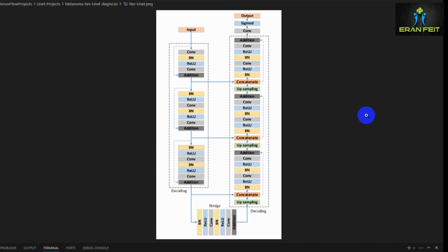As you probably figured out, it's a hybrid of two types of architecture. The one is the UNet model, which is shaped like a U, and the next one is the residual network, which is built of components that have a shortcut or bypass inside those blocks. But first of all, let's explain some more.